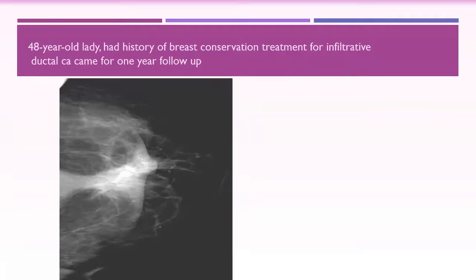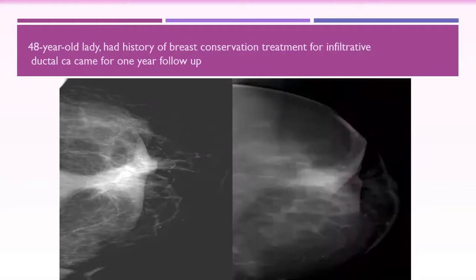I need further imaging like ultrasound. Okay, but they said follow up after one year. You did not ask for the previous. You have to look for the previous.